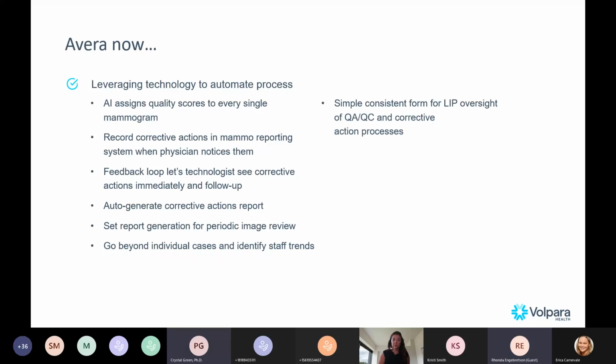Also it was a learning curve for us as well, because I learned that I have some radiologists that were just marking good exam for everything. And then ACR comes around and does spot inspections, and we had 2 sites fail for positioning. So it really opened our eyes to our process. Like I said, Equip has been good, even though it's been time consuming. We've identified some problems positioning wise, and also with our interpreting physicians.